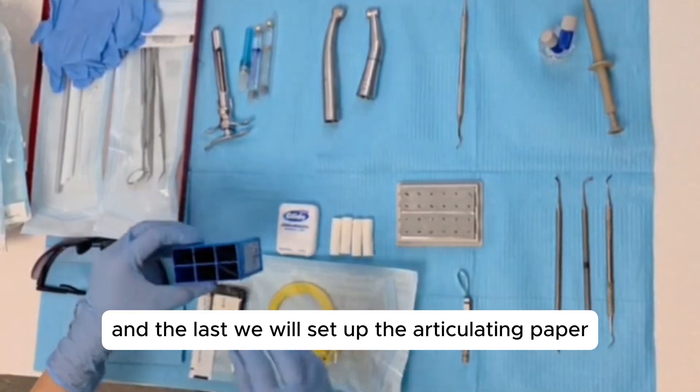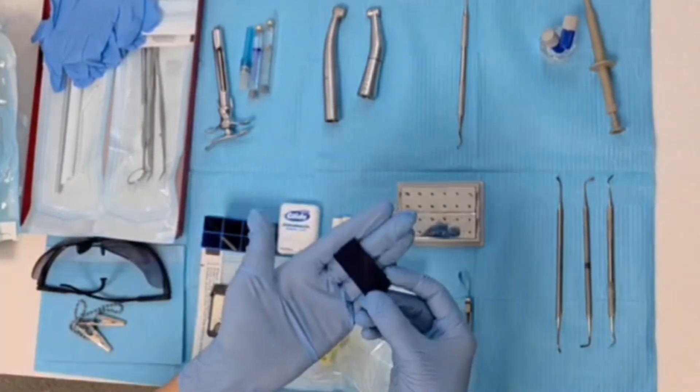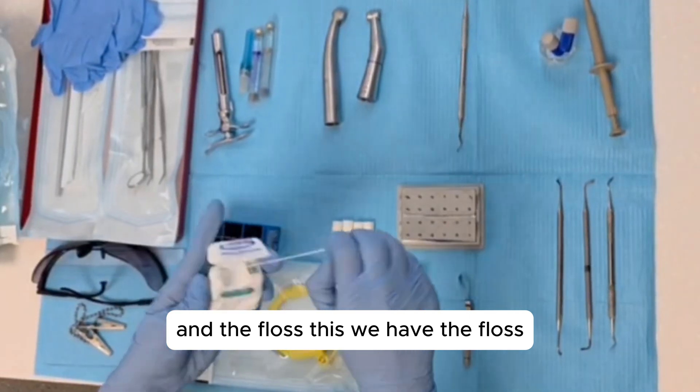And lastly, we will set up the articulating paper and the floss. These are the articulating paper, and this is the floss.